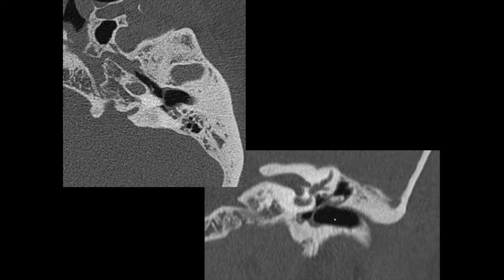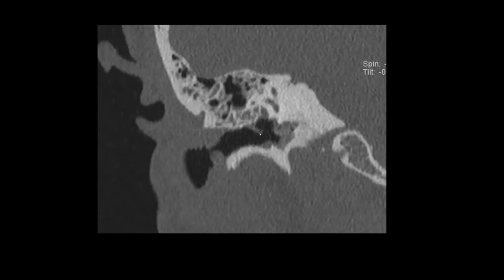if there's a perforation. But again, as I mentioned earlier, if you see the membrane really well, like you do here, it's thickened. And this one is very thickened and retracted all the way to the cochlear promontory. It's touching the promontory, and you can imagine that's going to impede the movement of the membrane. And again, this here is a perforation. You see a frank defect centrally.